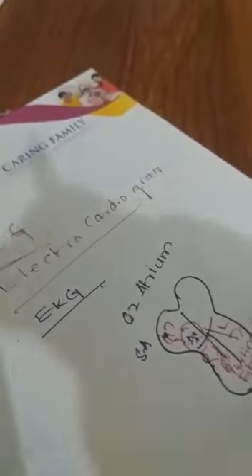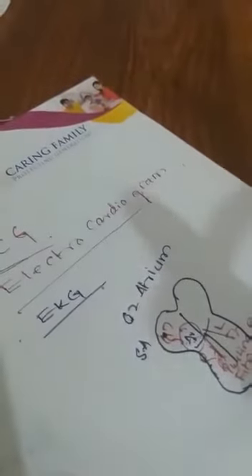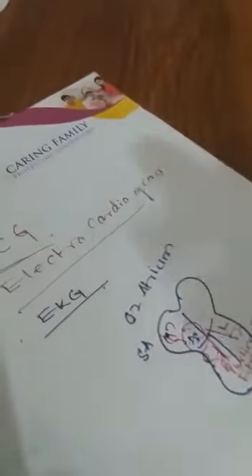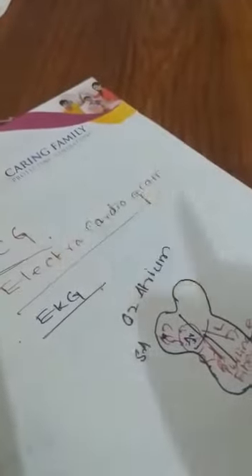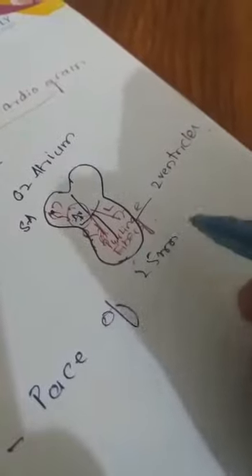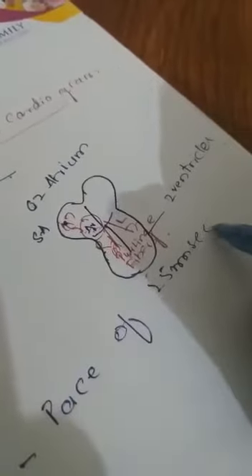Now I am proceeding to the second stage of the ECG: what are the fundamentals of ECG. As we all know, ECG has a machine. The machine and its stylus run at a pace of 25 millimeters per second. Okay.